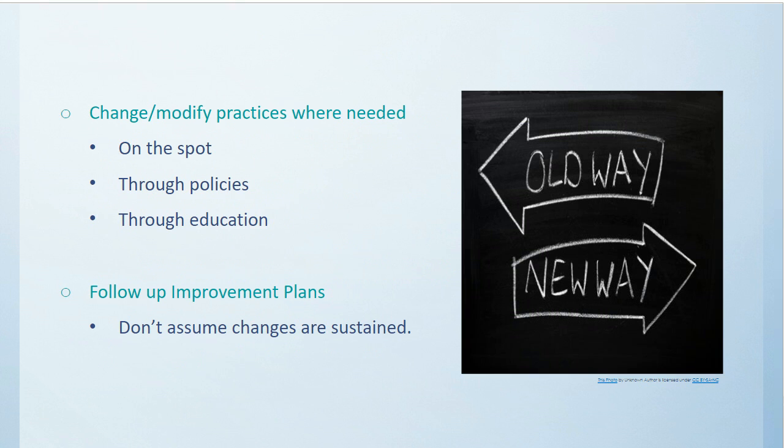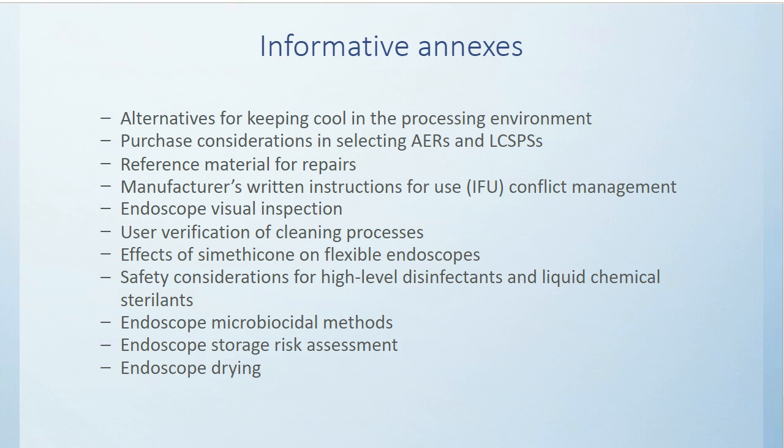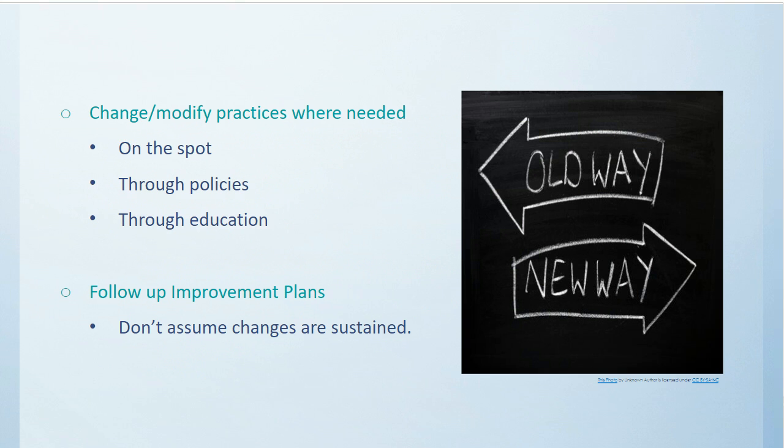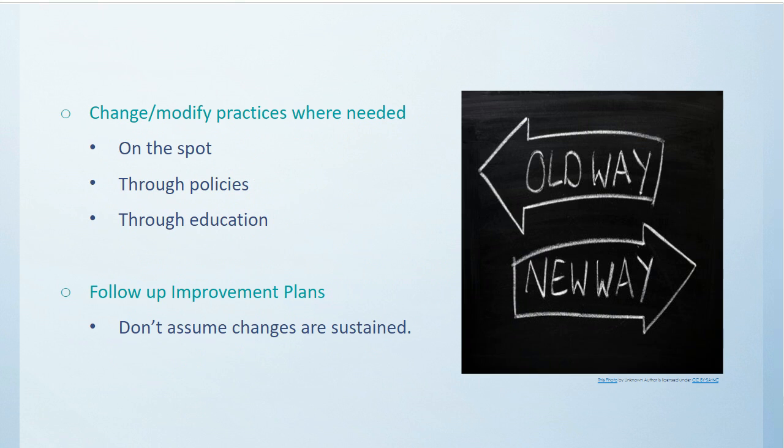And thank you, everyone. Thanks, Marianne. So we can mitigate and or remove risk by standardizing processes. That's something that we need to look at system-wide, and thus we limit deviation from best and expected practices. Also, we can mitigate by limiting the number of sites and staff expected to perform these very detailed critical tasks.